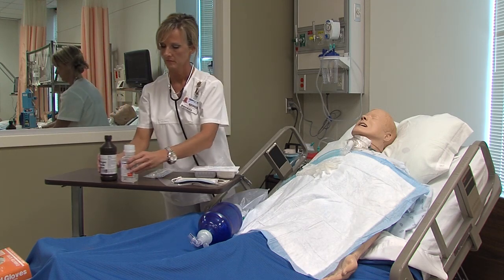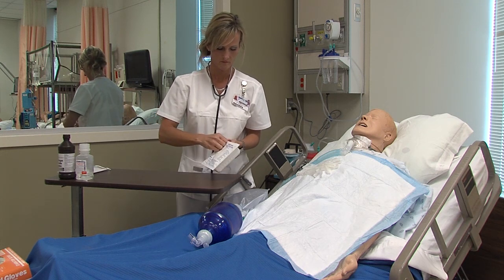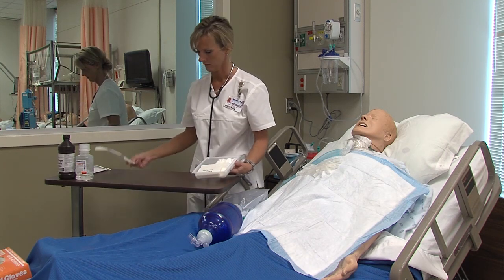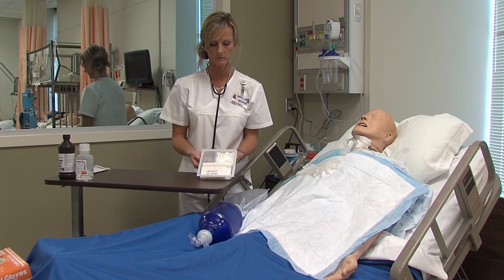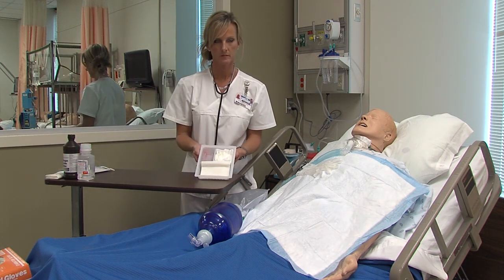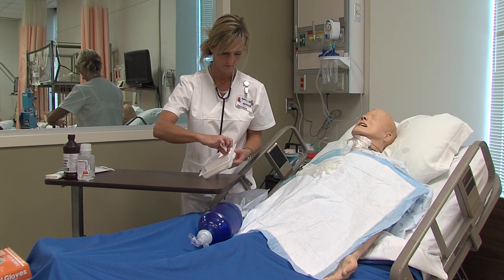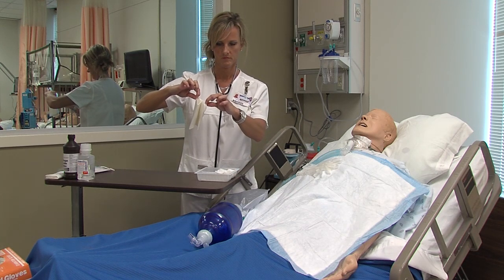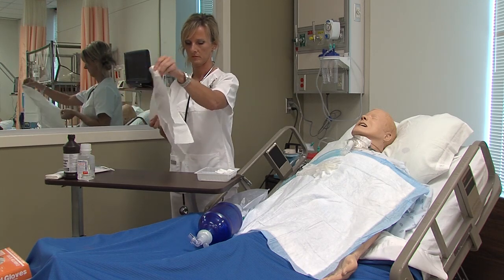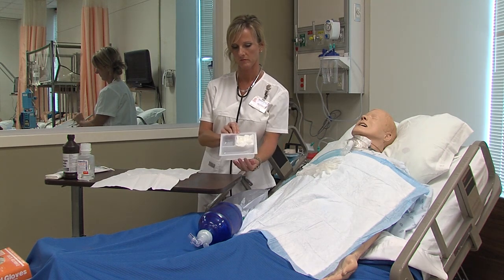Open your tracheostomy care kit. Remove the packet of sterile gloves from the kit and lay them to the side for now. Remove the sterile drape from the kit and place it on the table.